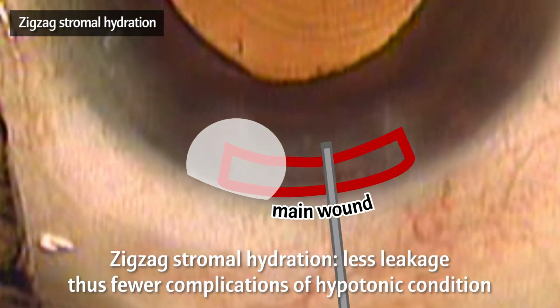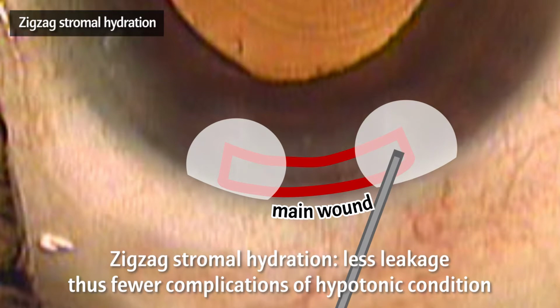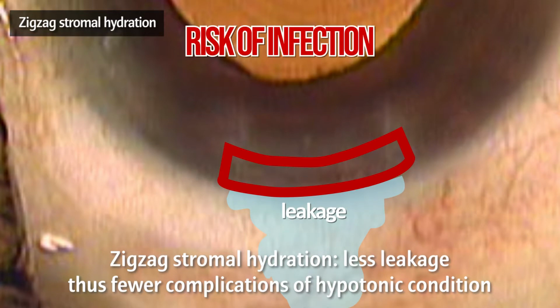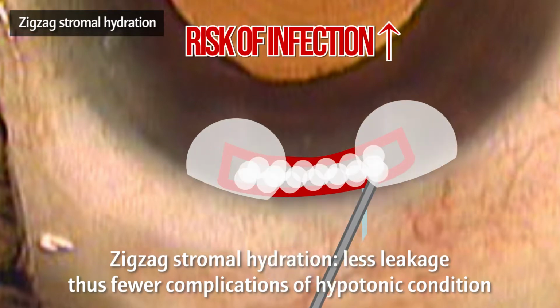Compared to the general method, this method allows you to inject less BSS into one spot and seals the wound all the way to the middle of the main incision. It reduces the possibility of leakage, thereby reducing the risk of complications of hypotonic states, such as endophthalmitis.